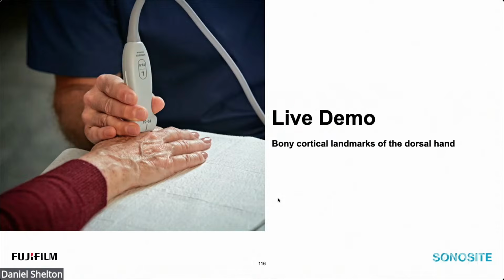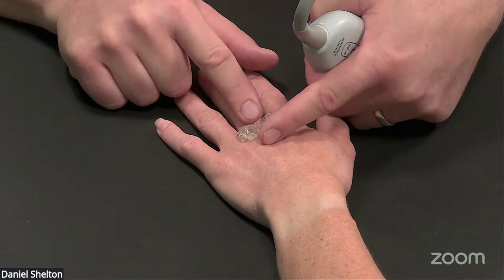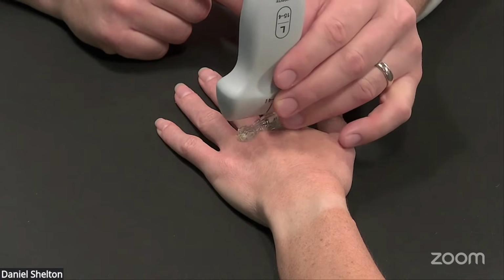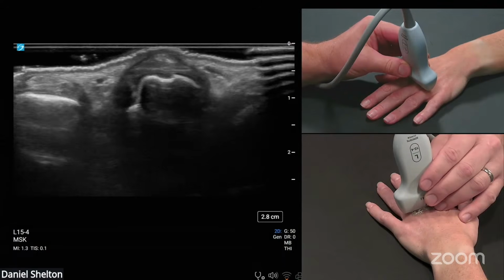We'll go to the live demo quickly. I tend to show people how to start this scan when there's a single tendon over the joint and not these variations with two tendons over the joints. Finger is hanging down below so that I'm in control of my pressure into the gel heap. Slowly rest the transducer into the gel. To optimize this image, I'll begin by decreasing my depth.